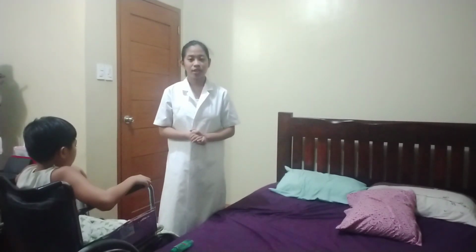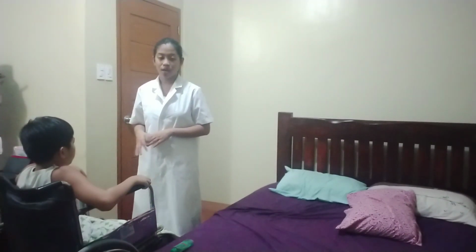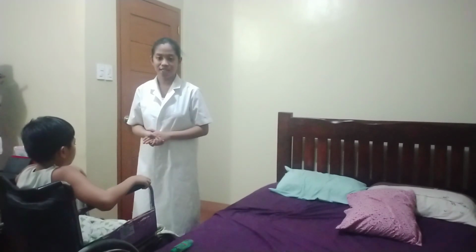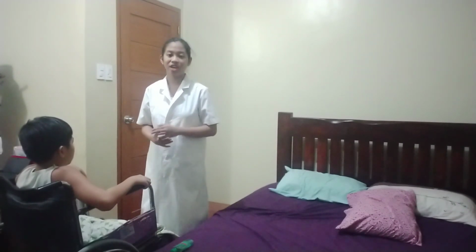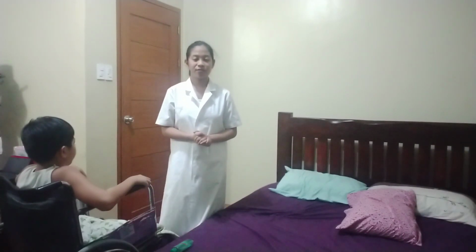And then for the documentation, I will document the activity, the length of time the patient sat on the wheelchair, the other pertinent observations, and the patient's tolerance and reaction to the activity. And I will document the use of transfer aids and the number of staff required for the transfer. So that's all for the transferring of the patient from the bed to a wheelchair.